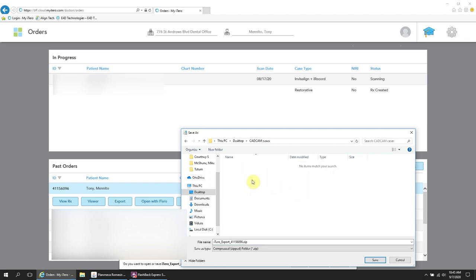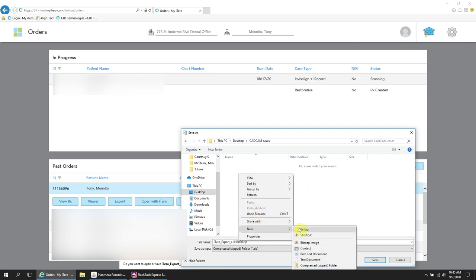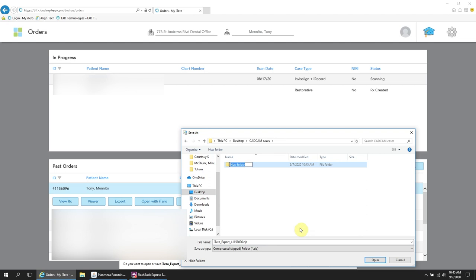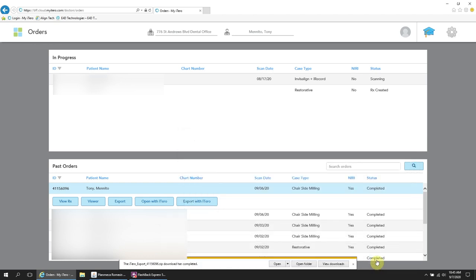I have a folder on the desktop for all my CAD CAM cases. I will add the patient's name. In this case, I'm just going to say iTero demo is the patient name. You click on that folder and that is the location that you want those STL files to go.